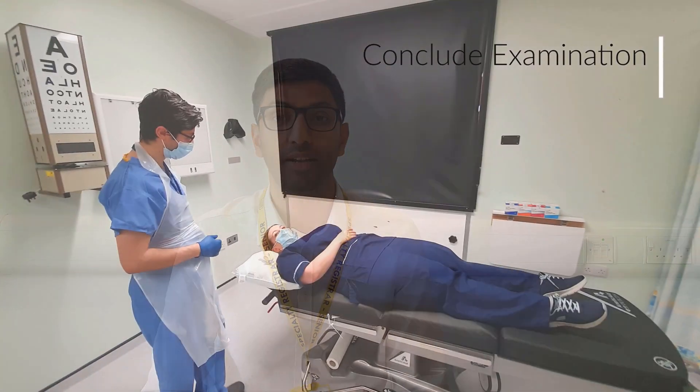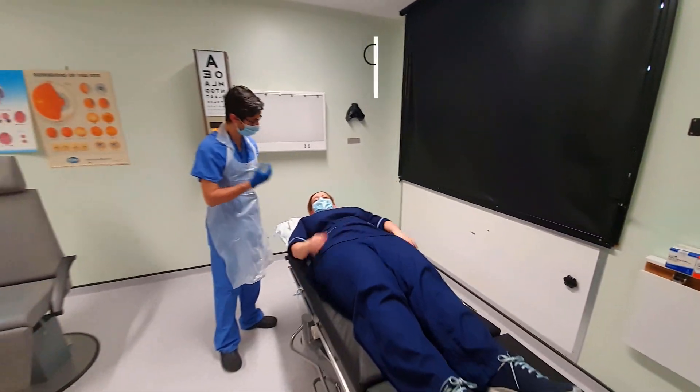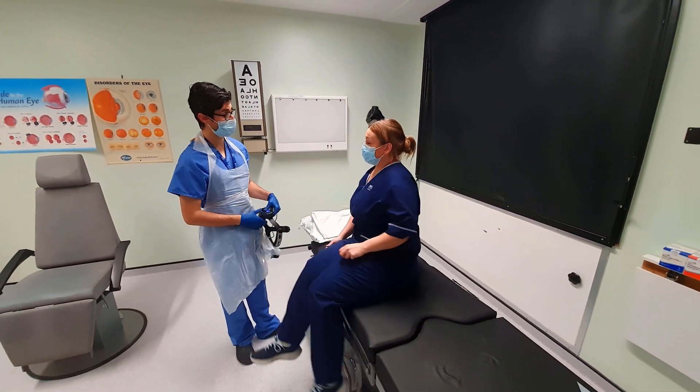You should thank the patient and give them ample time to recover from the examination before they stand up. Document your findings and inform the patient of your conclusion if appropriate.